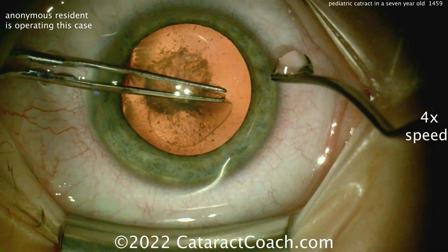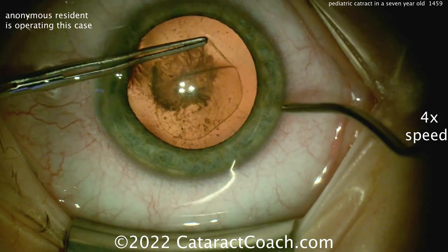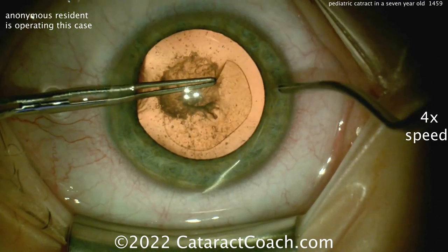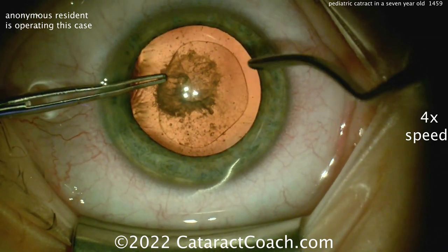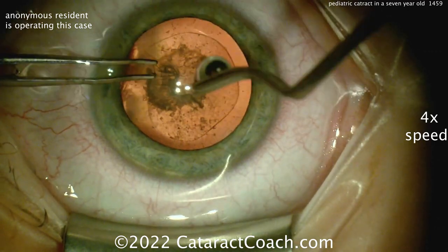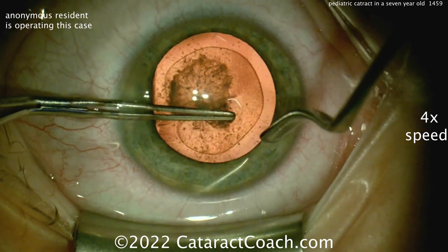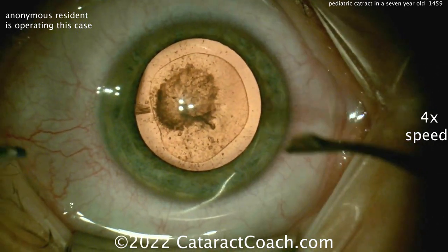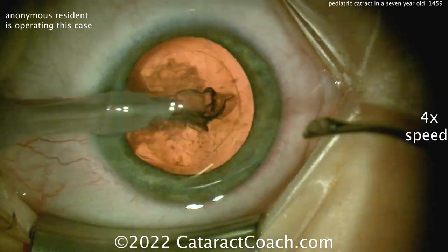Getting that rhexis back on track — good teaching here from the attending. Notice how the resident has to keep pulling this rhexis inward; it wants to run out because it's so elastic. In a case like this, you definitely want to make the rhexis continuous — you don't want it to run out anywhere. So my suggestions so far: make the incision hit the limbal vessels, and use trypan blue dye to stain the lens capsule, because that staining will make the capsule less elastic.